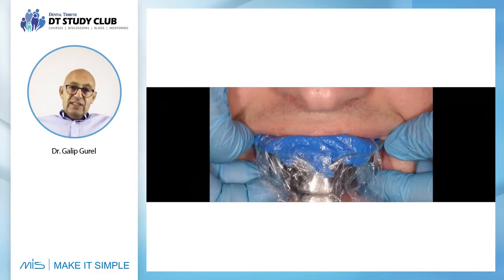Well, again, like we did in our previous cases, just maybe to use his own tooth as a provisional, I just wanted to make an impression, but look how carefully I'm making this impression. I have a nylon laid over the silicone so that the silicone won't cover the interproximal embrasures. I can make sure that if I did it like this, and when I take the impression out, the tooth would have come out so easily. So this is, we bonded the two teeth together, and then this is how we made the impression.